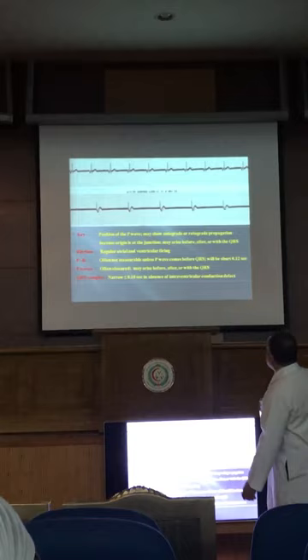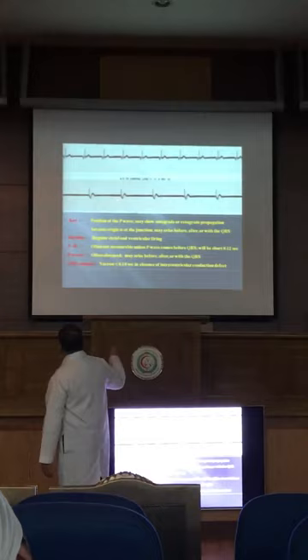We have to talk about junctional in more detail, because you notice that here the P is negative but before the QRS, and here the P is negative but after the QRS. Why?